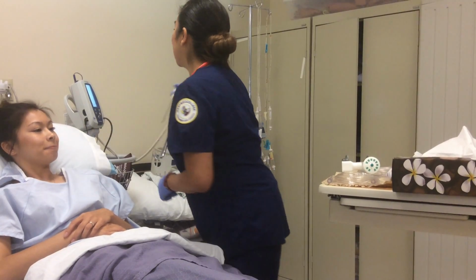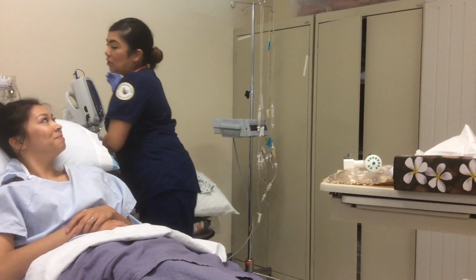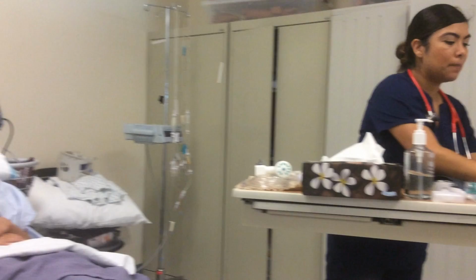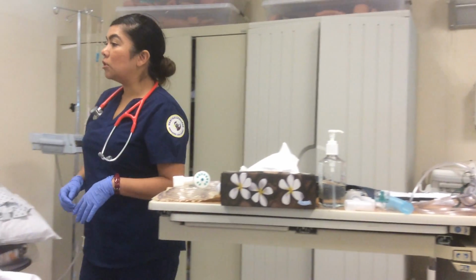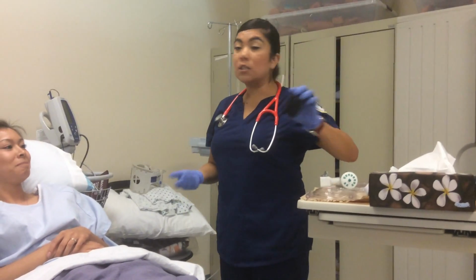Very good. Okay. Thank you. Okay. Very good. And so it looks like it's 98.7, so we're good with that. Okay. And then what was your age and height? Okay, and so now what I'm going to do is check your oxygen saturation.